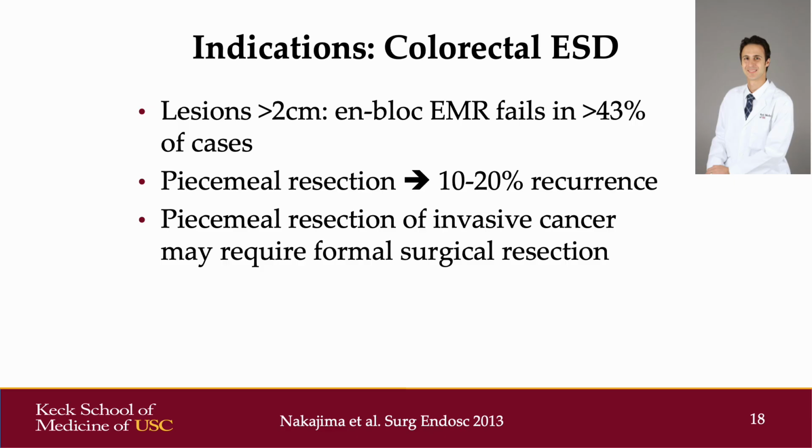Why would we want to perform ESD in the colon? Well, we know that for larger lesions, such as lesions above 2 centimeters, en bloc EMR will often fail in over 43% of those cases. We also know that when piecemeal resection is performed, there is a significant recurrence rate of about 10 to 20%. If piecemeal resection is performed of an invasive cancer, that patient still may require a formal surgical resection, as the margins cannot adequately be evaluated.